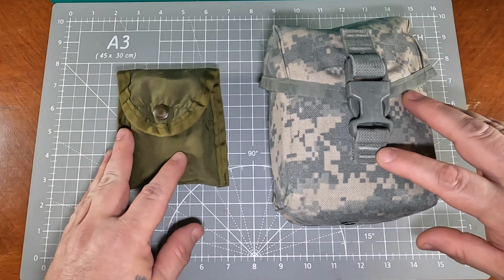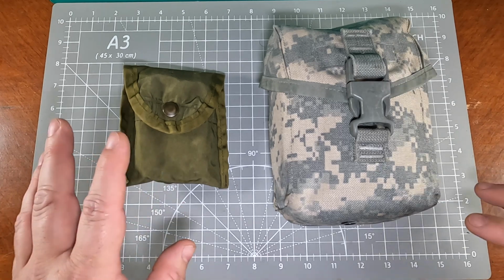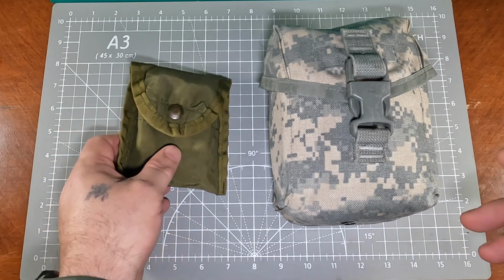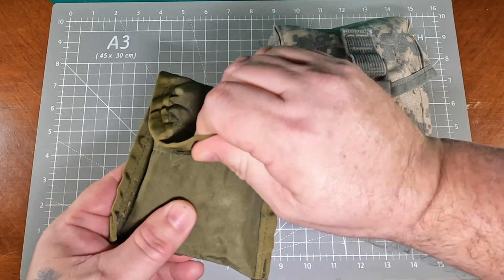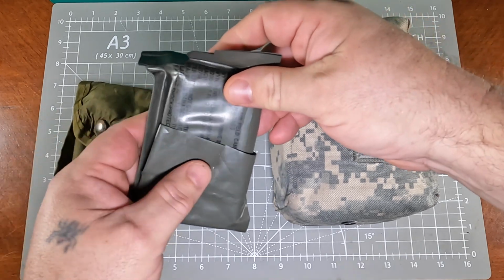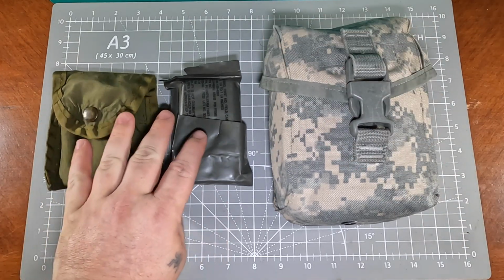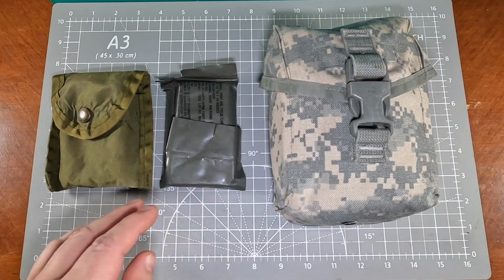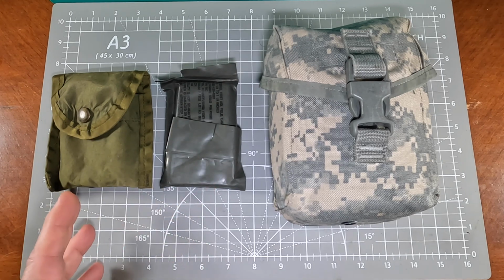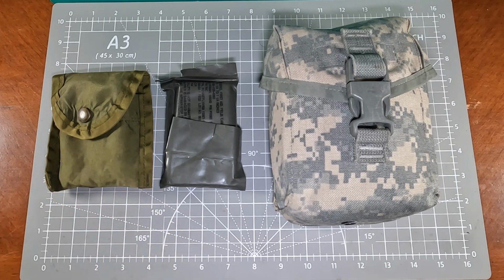Going over the aid kit stuff, like I said, in my vehicle I carry a bunch of stuff, and I'll do some videos on those. Today I want to go over some of the basic first aid things. When I first joined the military, we had these little pouches that contained first aid dressing, and basically it's called a Carlisle bandage. In the 1920s, it was designed kind of similar to, I guess, maybe a maxi pad with your strapping and wrapping already on it.